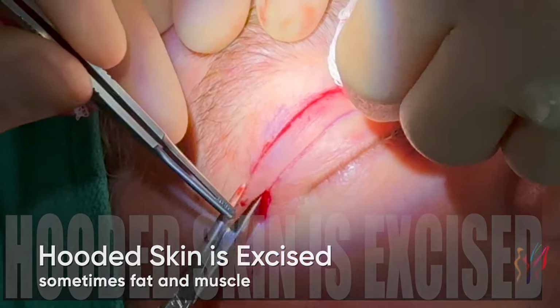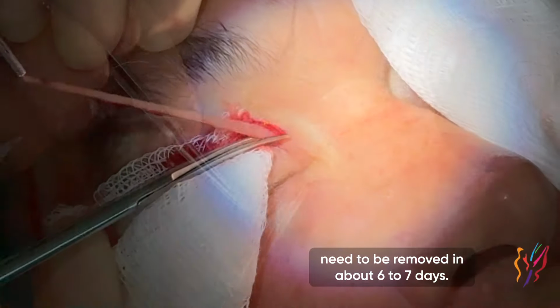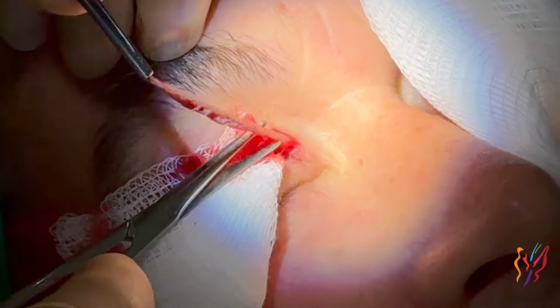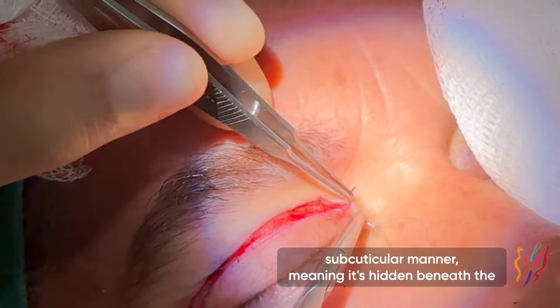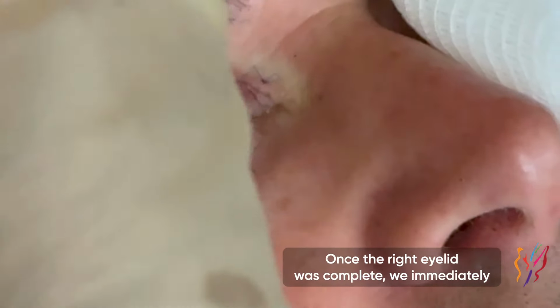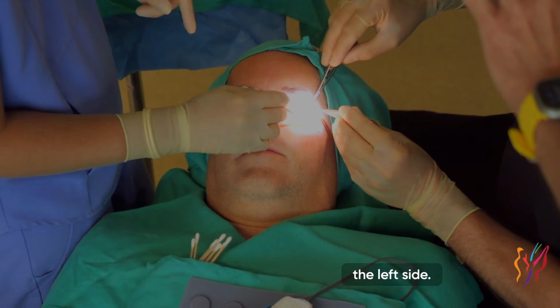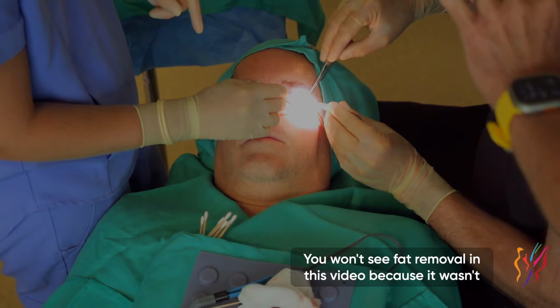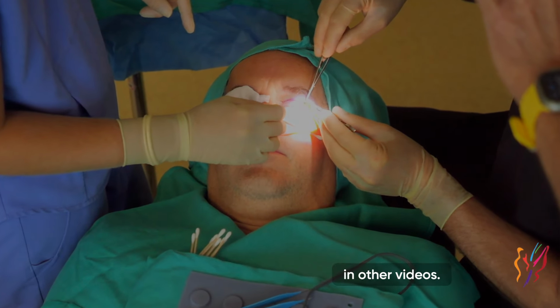After ensuring there was no bleeding, he closed the incision with a permanent suture, which will need to be removed in about 6 to 7 days. The suture was placed in a running subcuticular manner, meaning it's hidden beneath the skin for a cleaner result. Once the right eyelid was complete, we immediately applied ice to the area and began the same process on the left side. You won't see fat removal in this video because it wasn't necessary for my procedure, but we have shown this in other videos.